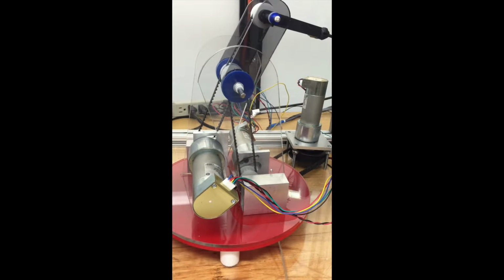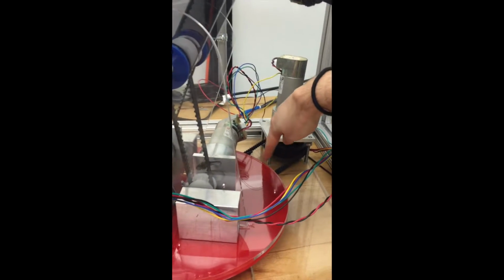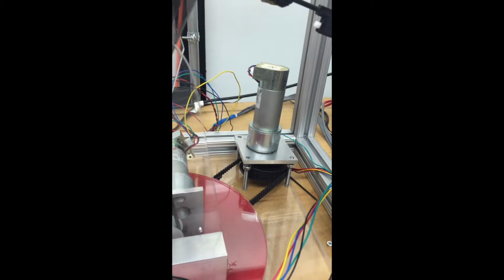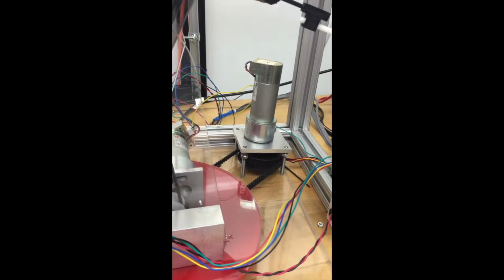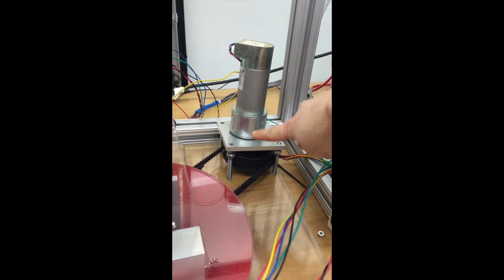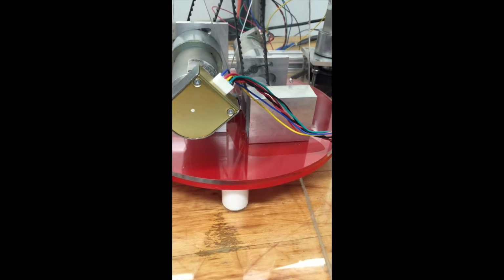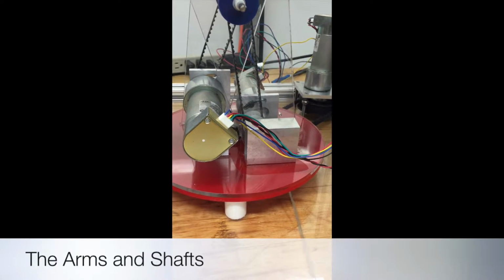The turntable pulley duo is driven by a belt and pulley system, which is connected to a motor that is mounted to a support table, which sits on the corner of the base plate. The support table is composed of 4 steel rods and an aluminum rectangular mount. There are nylon supports underneath the turntable to stabilize its rotational movement and stop wobbling of the turntable. The rest of the components of the robot arm sit on the turntable.